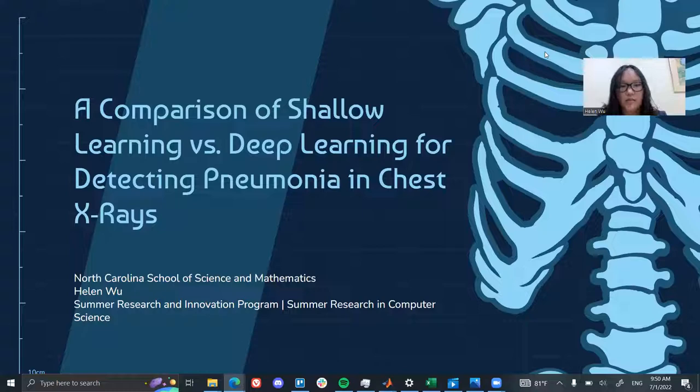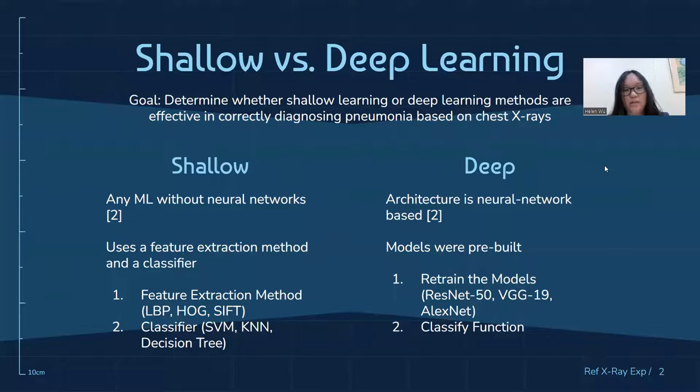Today, I will be discussing my project, which was a comparison of shallow learning and deep learning for detecting pneumonia in chest x-rays. So what is shallow learning and deep learning?